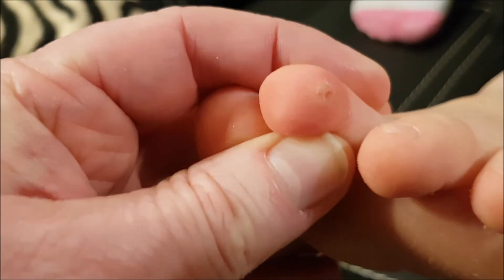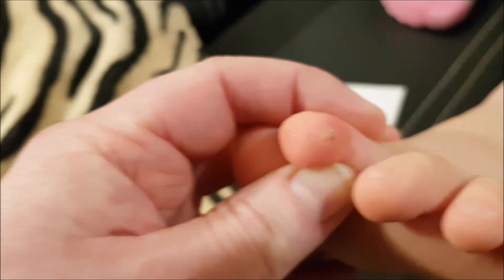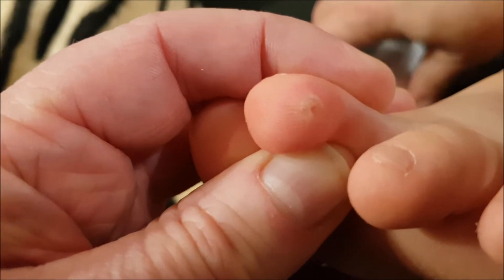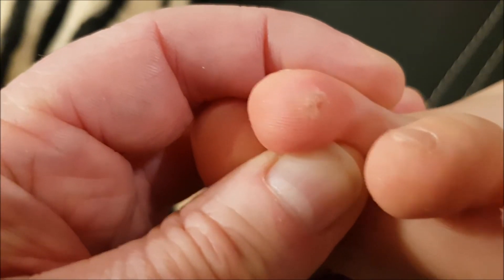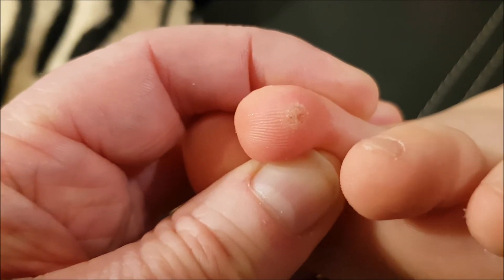It was frozen for about 40 seconds. Now we'll need to wait some time for the end result. After it's frozen it will fall off — I will show you the end results after a couple of weeks.